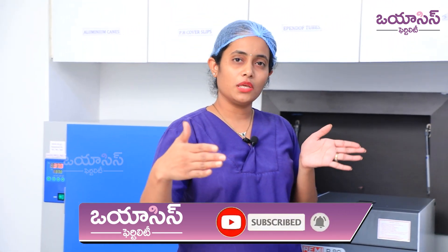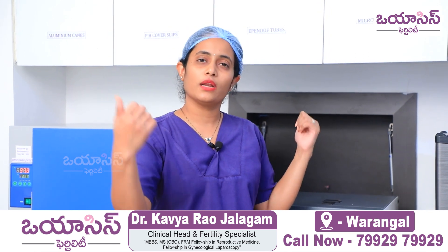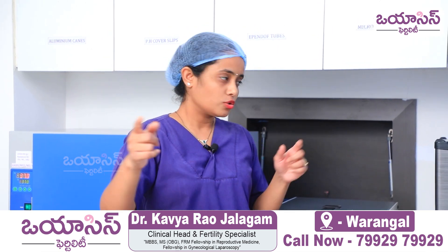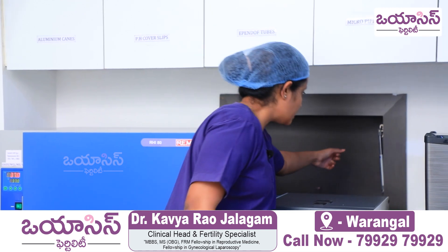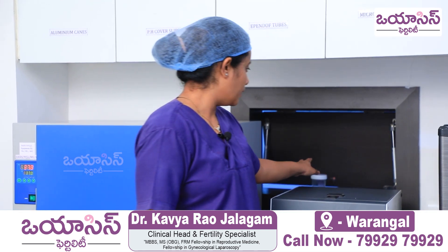This room is a small, compact room connected both to the semen collection room and the IUI room, with a window between them. This is the sample collection room, where the patient drops the sample, and this is the container.